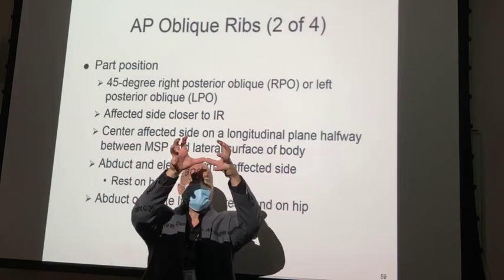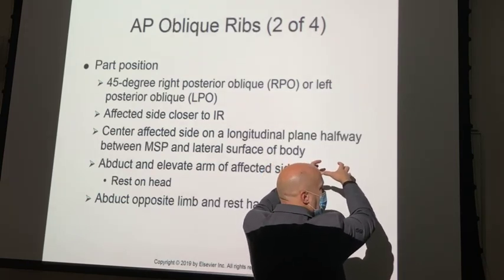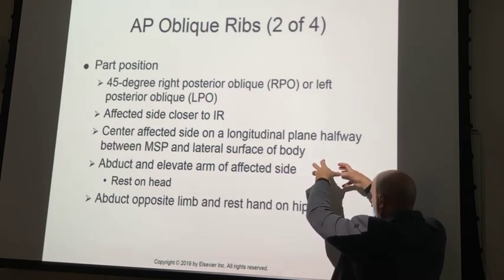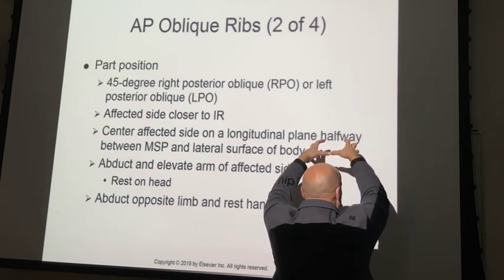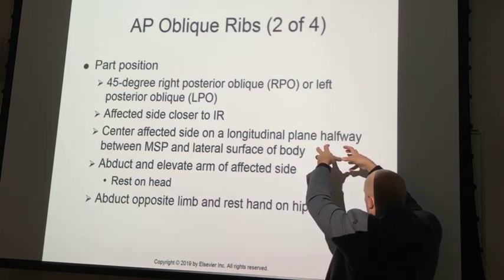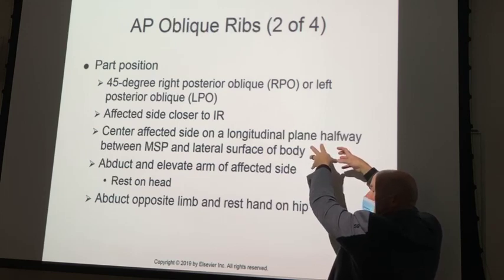So as we oblique, if we are PA, and the patient's complaining of anterior rib pain, then we oblique the patient. Which side closed up, and which side opened up? I'm kind of giving you a hint here. My fingers represent the ribs, and they're pretty symmetric right there, right? As I oblique, see what happened to my fingertips, the distance between my fingertips and the palm of my hand on this side? They kind of closed up, yeah? And this side really opened up, did it not?